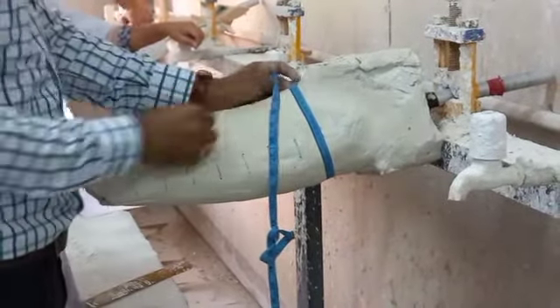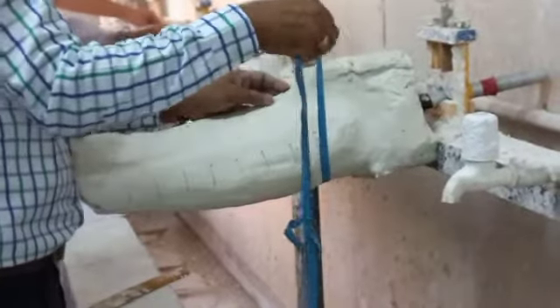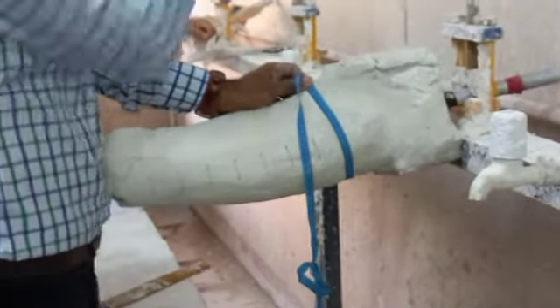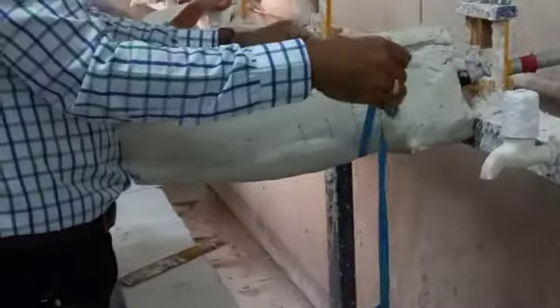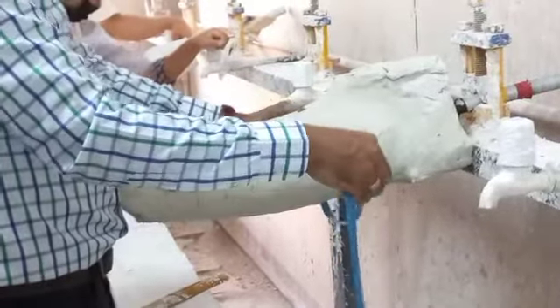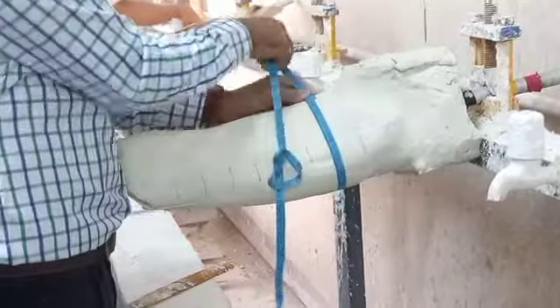Okay, 43.5 is the first measurement. You can say our first measurement was 4 centimeters below the lowest point of the IT, and that measurement is 43.5 at present. We have already reduced something from the lateral posterior aspect that day, right? We know that this measurement may be a reduced value.